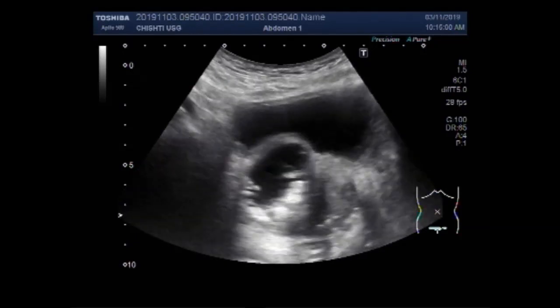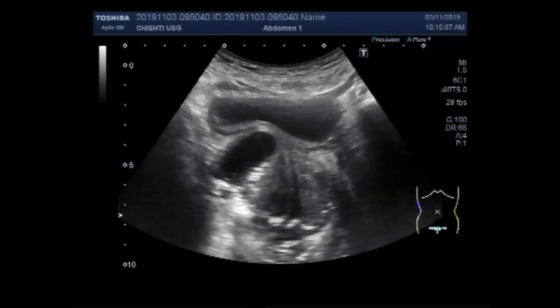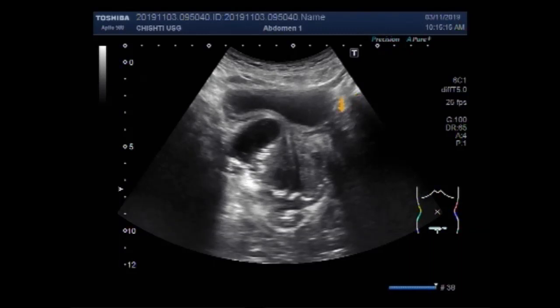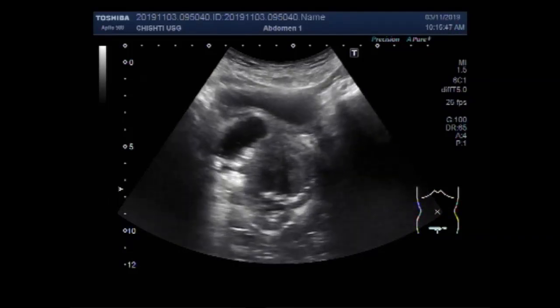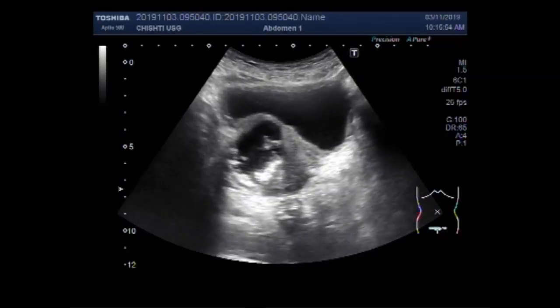Now you can see the ureter, the enlarged prostate, and the urinary bladder. You can see a cystic mass in the right lateral lobe of the prostate. This is the urinary bladder, this is the prostate, and this is the cystic mass. The cystic mass in the right lateral lobe of the prostate has invaded the distal portion of the ureter, causing the hydroureter and the hydronephrosis of the kidney.